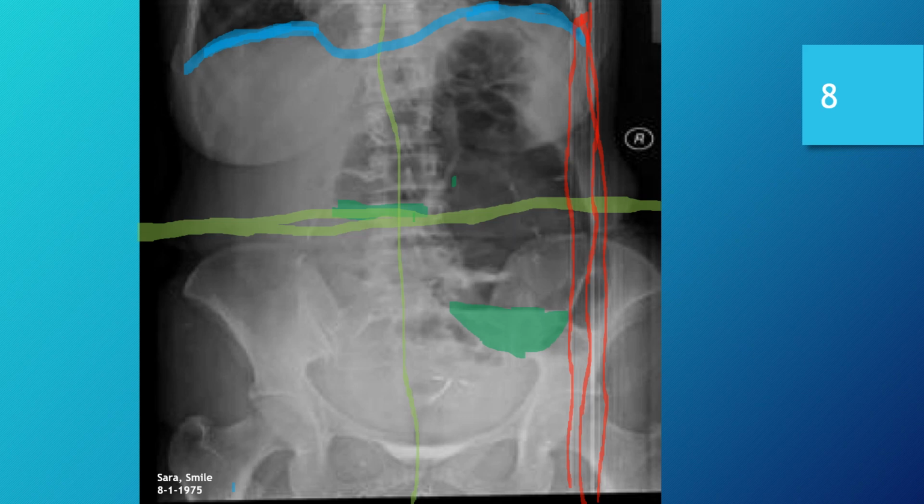with this exam. And so also to note, it is an internal artifact, so it's not something we can really do anything about, but there is an internal artifact here in the patient's lower abdomen, pelvic region. From what I can tell, it looks like an IUD. It'll be helpful to be familiar with those so that you don't ask the patient to remove something that they can't obviously remove. But yeah, that's what that appears to be externally.